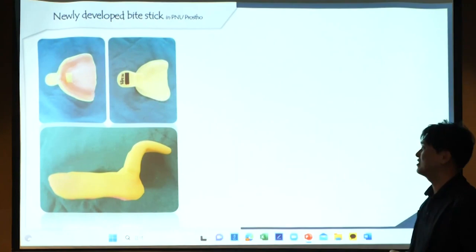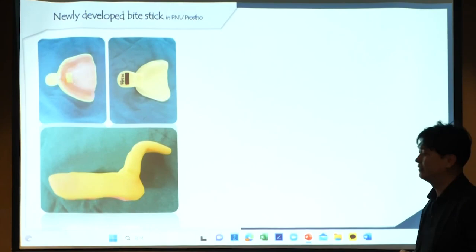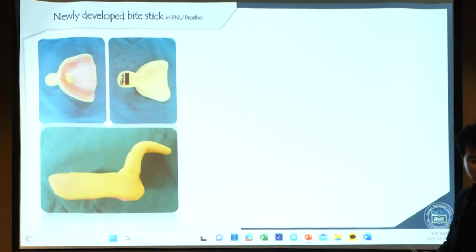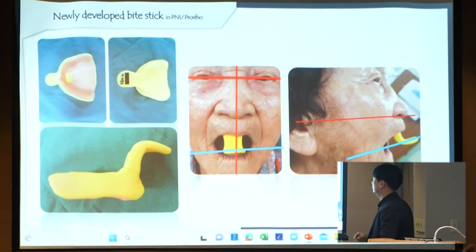It's a strange tray. So before developing this device, I was always annoyed by this tray shape, but nowadays I accept it. Yes, no problem. There's no problem. Anyway, after taking the impression, the tray handle was not following the occlusal plane like this.